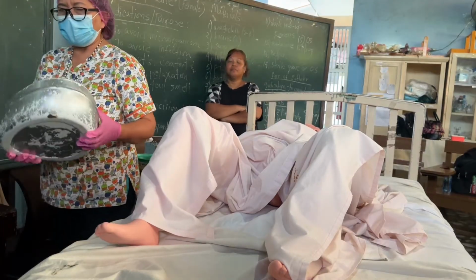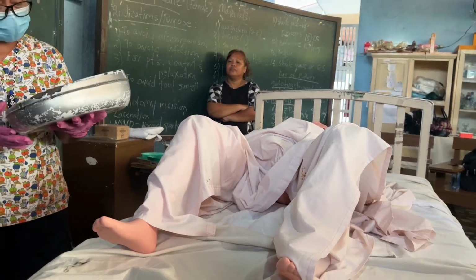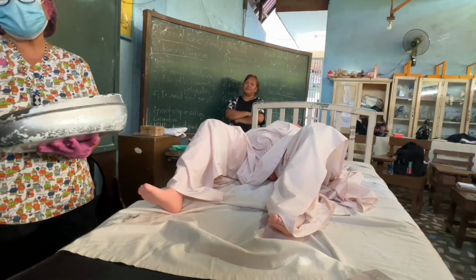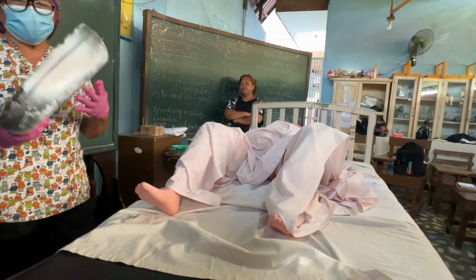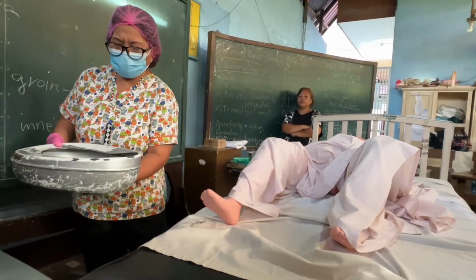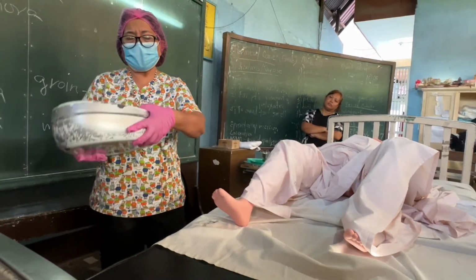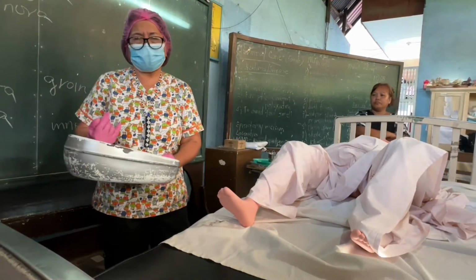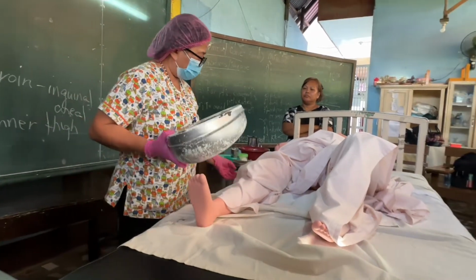This is the bedpan, class. There are 4 kinds of bedpan. One is made of this stuff. Stainless, enamel, aluminum, and also plastic. If you're making use of a stainless bedpan, you're going to pour warm water inside, swirl, and then throw it. The purpose of this is to minimize the coldness of the bedpan. And then you test the temperature, so the pan is not so hot that you might scald the patient.